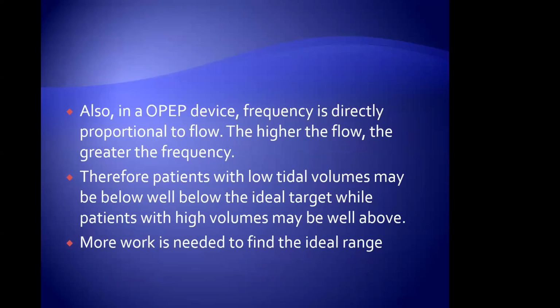That makes sense. The higher the flow, the greater the frequency. The patient takes that breath in and blows out slowly. Not so much, take that big breath in and it breaks it up. You've seen it, you've done it. Therefore, some patients' low tidal volumes may be well below the ideal target, while other patients have high volumes well above. More work is needed to find the ideal range.